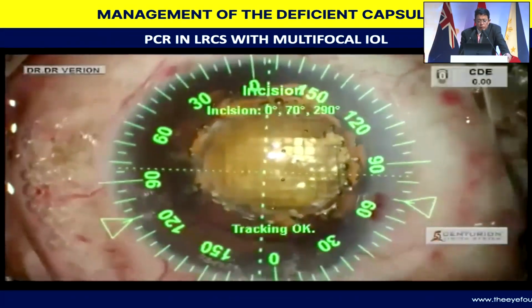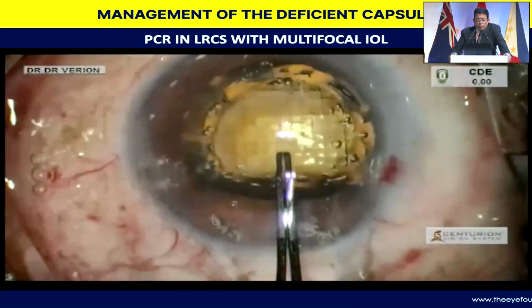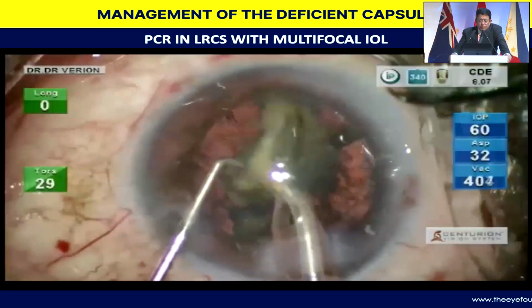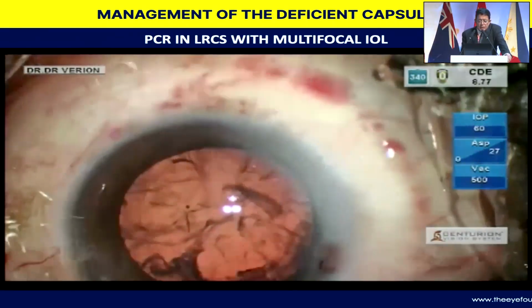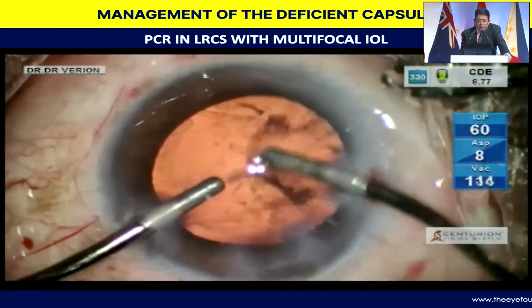And you can have problems. This was a gynecologist friend of mine. One eye already operated with a premium intraocular lens a week back. Fairly routine surgery, fairly dense cataract. And you can see that the first time I suspected something wrong was when I found that there was something floating in the anterior vitreous.